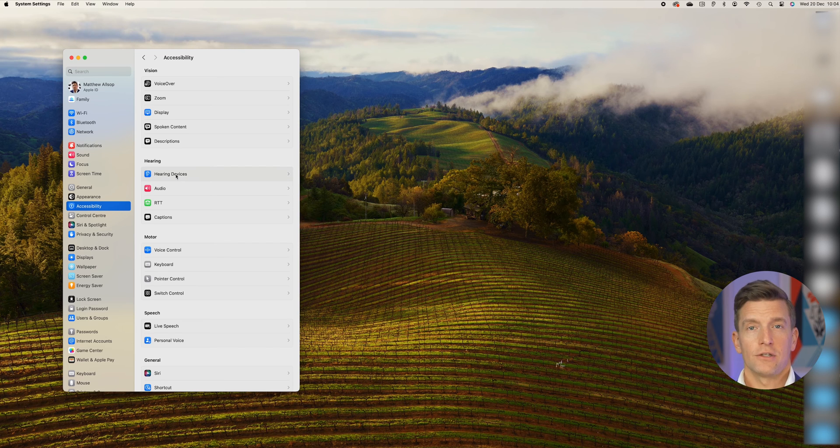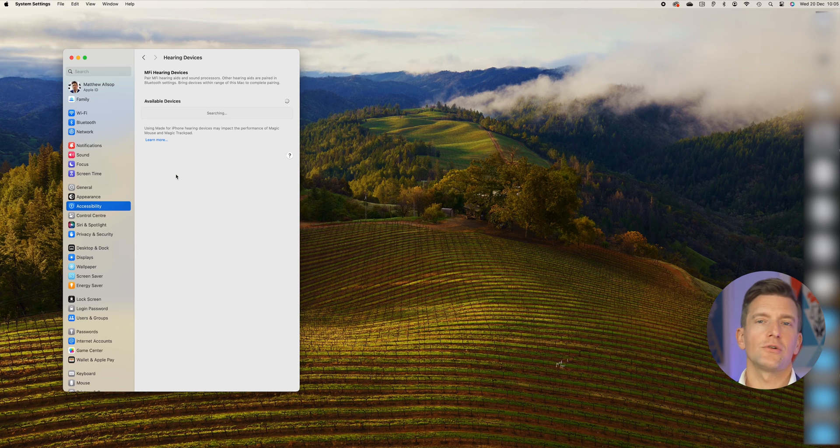Almost halfway down on the left-hand side, you will see the blue Accessibility icon — click into this menu. Now you should see the Hearing menu. Click on Hearing Devices, which is shown at the top. At this point, you'll need to put your hearing aids into pairing mode. To do this, you have two different options. If you have the battery version, simply open and close the battery doors on both of your hearing aids, making sure that you have fresh batteries. Alternatively, if you have the rechargeable version, simply place the hearing aids in the charger for one second and then remove them. Your name should now appear at the top of the screen along with the model of your hearing aids.